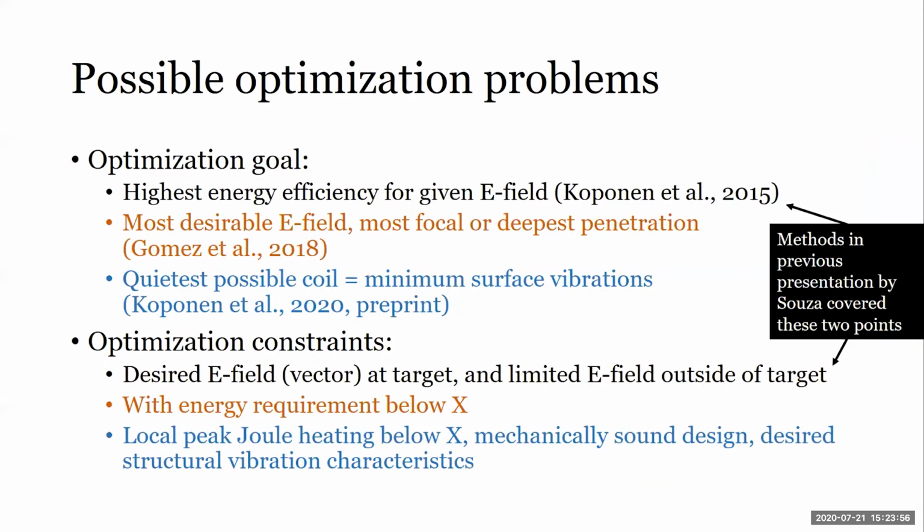So of course the optimization problem that Victor showed was the energy efficiency. Rasmus also introduced and talked about the power efficiency. So basically these are energy efficiency, minimize inductance, and power efficiency, minimize resistance, for a given stimulation field. Here we use the E field, the induced electric field, as our target, but it's just a linear map away from the magnetic field for these frequencies.